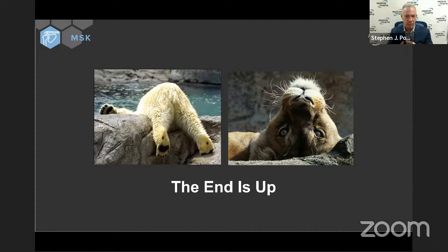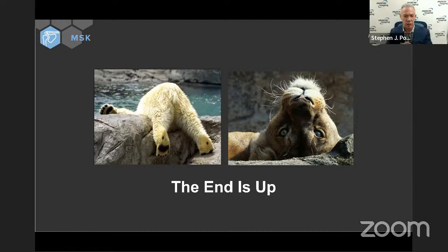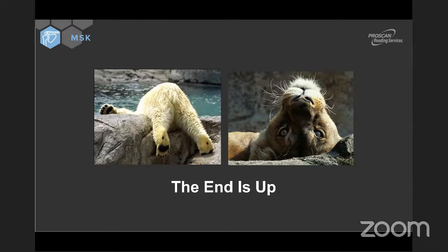Great question. This one is, the trochlea is for the AVN and the other lateral side is for what? The trochlea is for AVN and the capitellum is for osteochondral defect, usually seen with valgus extension overload. Next question. This one looks like the last one in the queue right now.